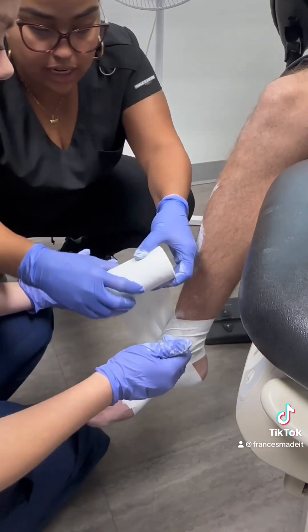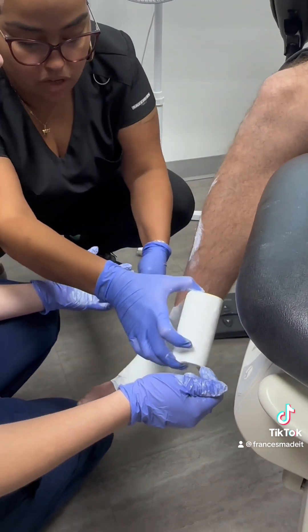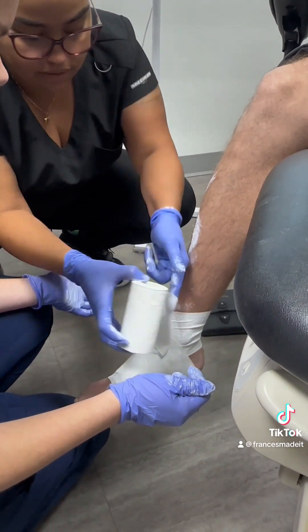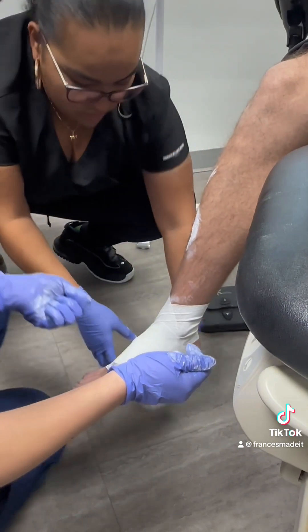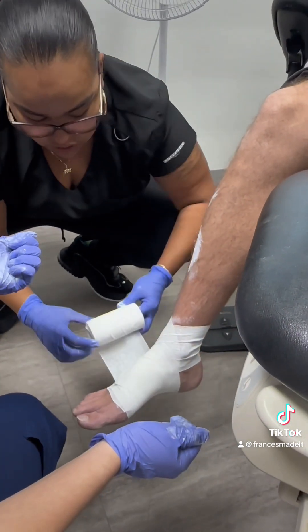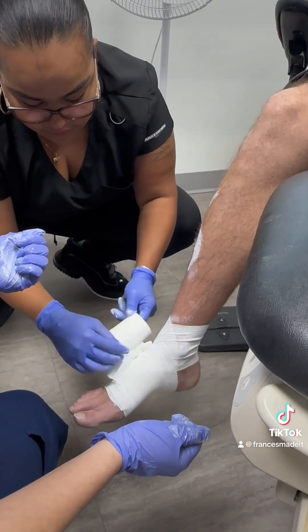To keep it nice and neat: the tighter you keep this, you kind of fold it this way — keep your folds together.